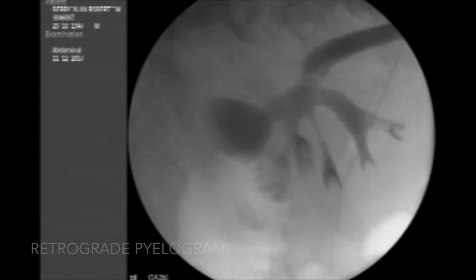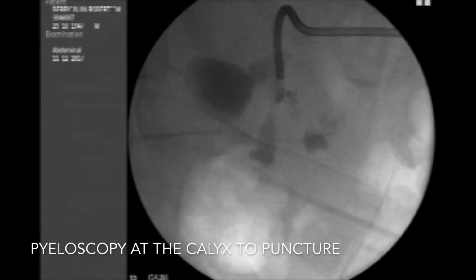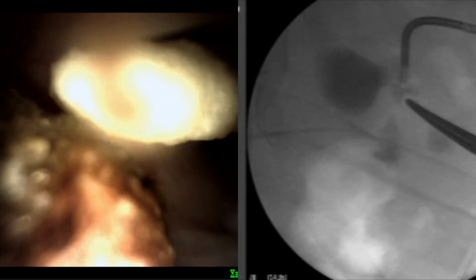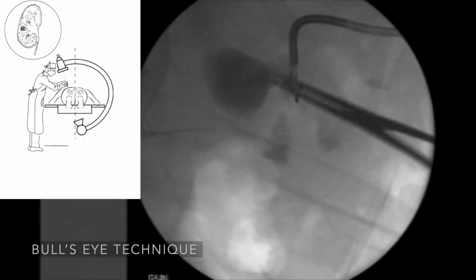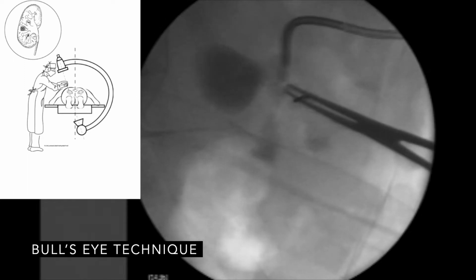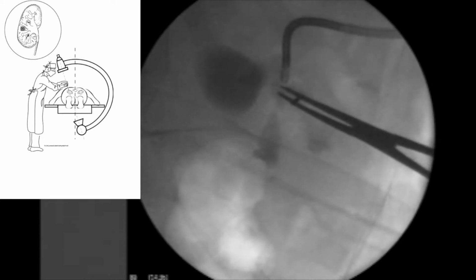This is the intraoperative retrograde pyelogram, which showed the collecting system anatomy, and here's the LithoVue ureteroscope that's over the interpolar region. You can see here that it's actually quite medial in targeting, and this is where doing it under vision gave us confidence that we're in the right place. Otherwise it's usually quite medial and quite disconcerting.